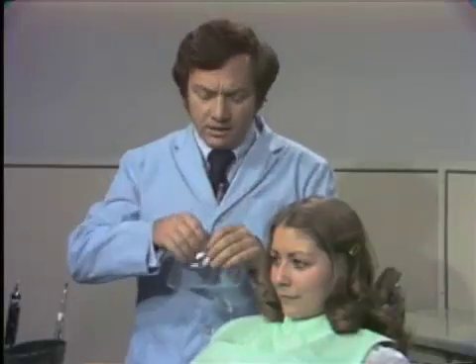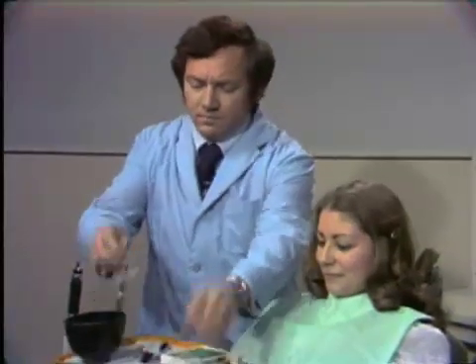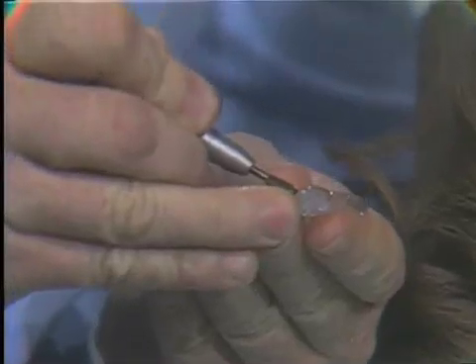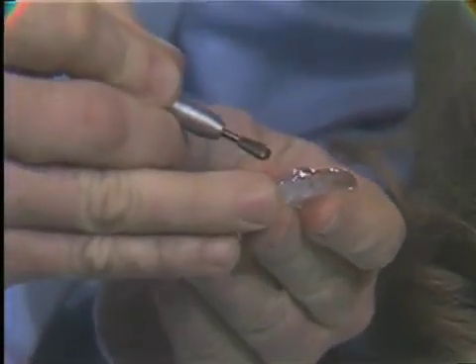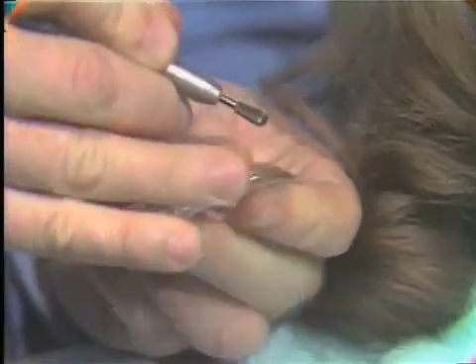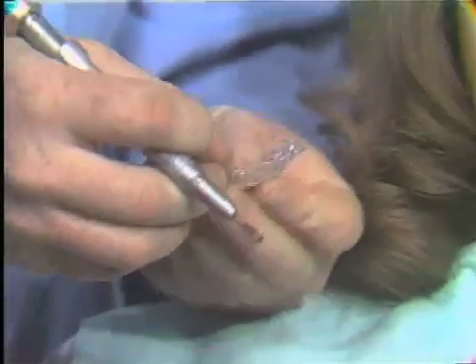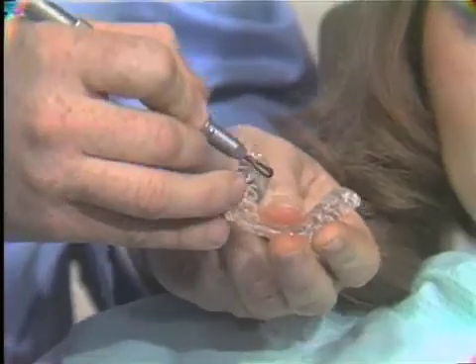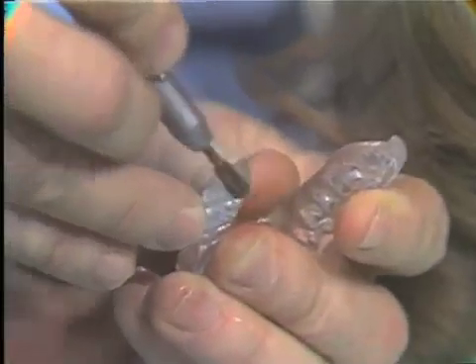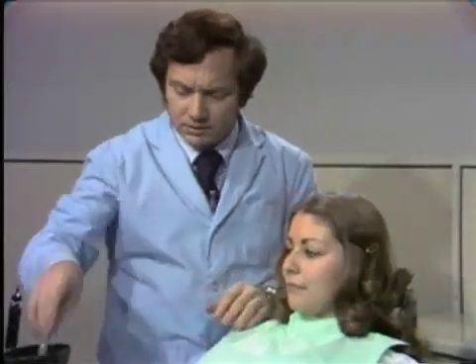Upon receiving the acrylic occlusal splint back from the lab, the first thing we have to do is check the fitting surface. We have to adjust the gingival marginal area to make sure there is no impingement of the sharp acrylic edge upon the gingival tissues. The next stage is to check the occlusal surface — make sure there are no sharp surfaces on the lingual. In this particular splint, notice the curve coming from the buccal to the lingual, so we don't have to do any adjustments. Now let us try this acrylic occlusal splint in the patient's mouth.